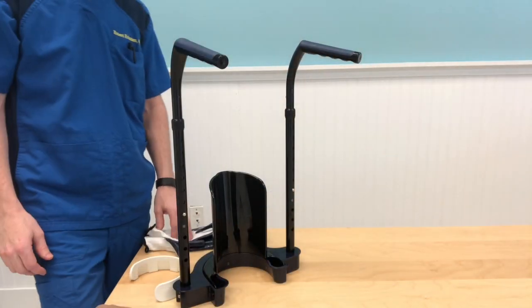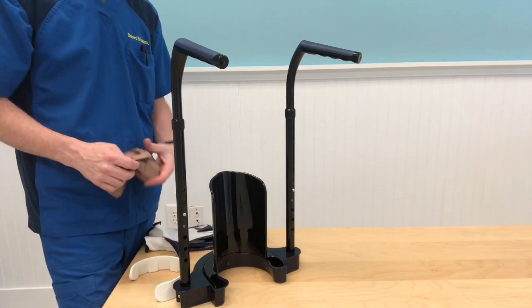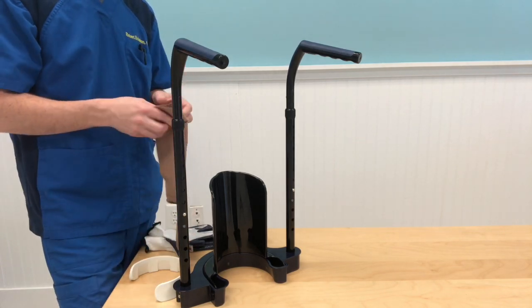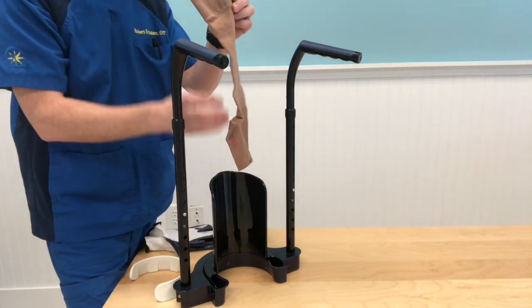We recorded this little video to show how to use the Simon to put on compression socks if you have a difficult time reaching your feet. Hope this will be helpful. So I'm going to show how to load the compression socks on the Simon, the device for putting on compression socks without reaching your feet.